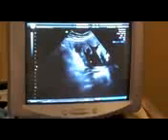During assessments of fetal well-being, the fluid is measured by measuring the one fluid pocket in each quadrant. We kind of artificially divide the uterus up into 4 different areas, and the fluid in each quadrant is measured. There's a large variation in what can be considered normal, and there is a very normal amount of fluid here today.